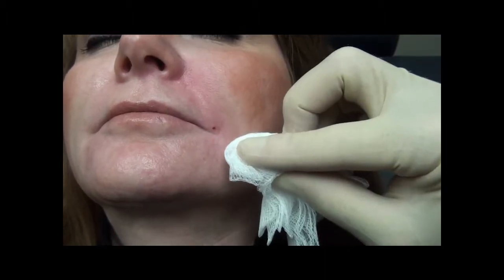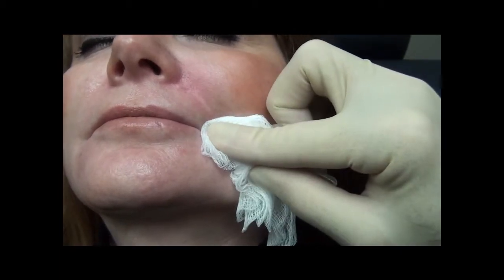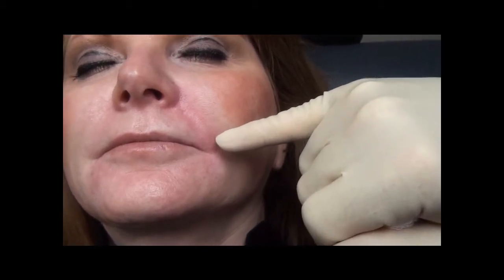We will hold pressure until no further heme comes from the injection site. There is no further heme coming from the injection site. You can still see the nice wheal in the injection plane. You can see the difference between the injected left side and the patient's non-injected right side.